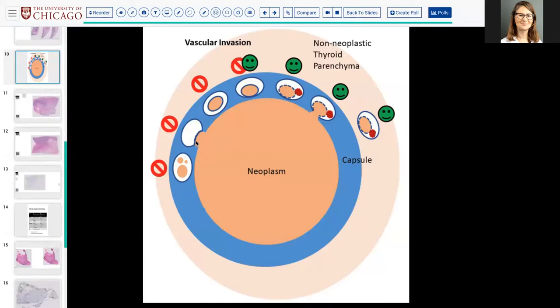When you have pushing of a tumor nest into a vessel with endothelial undermining, this is also not considered invasion. Some people also do not consider invasion when you have endothelialization without fibrin thrombi or adherence, because this could be just like an intussusception, right?